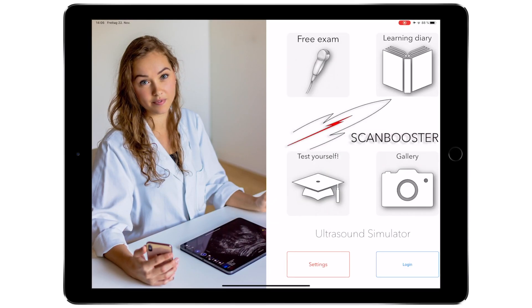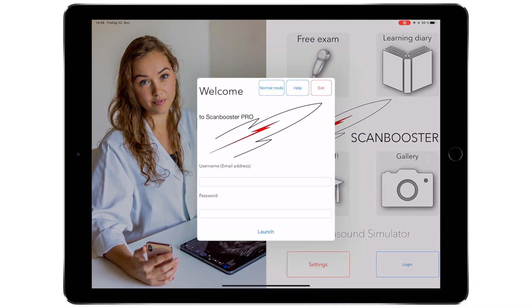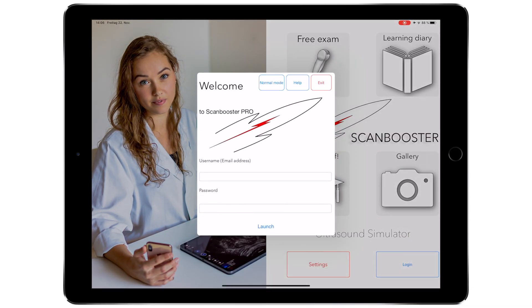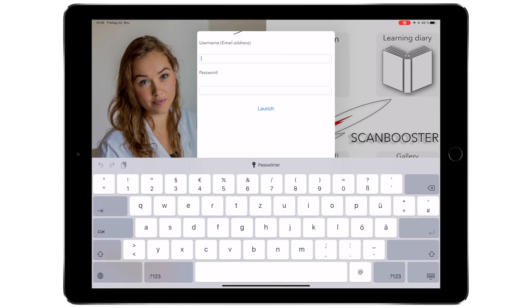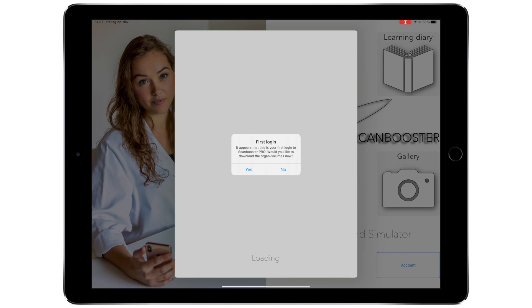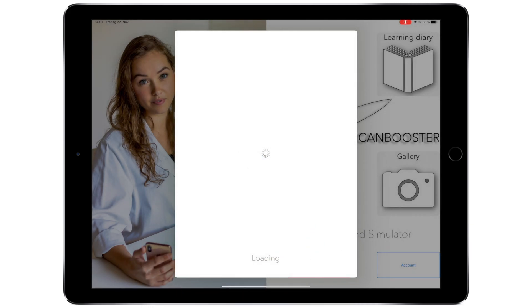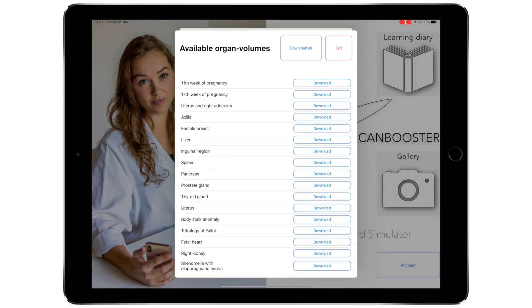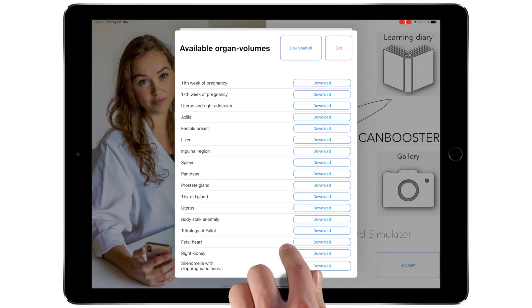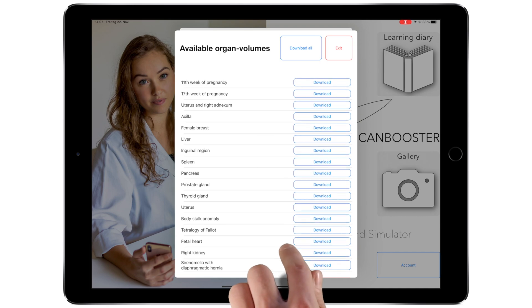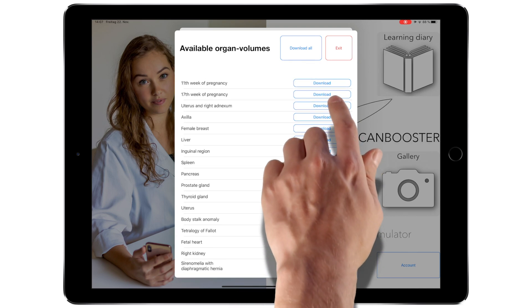Please start by clicking the log in button on the main page. Now supply your email and your password. After successful log in, you can start by downloading the organ volumes.